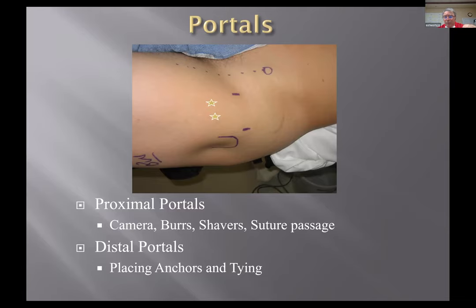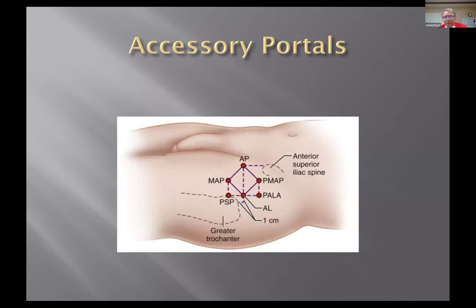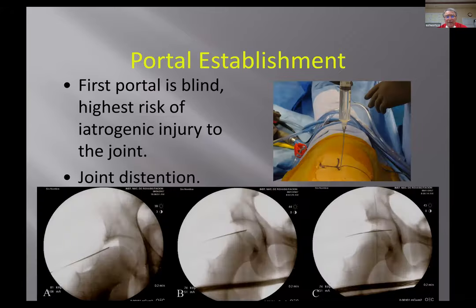These accessory portals with the little stars are for inserting anchors and tying knots. And those are called the DALA, or the distal lateral anterior portal. And all these different red dots are accessory portals that you can use to get in the hip. And that's a pretty safe area to work in.